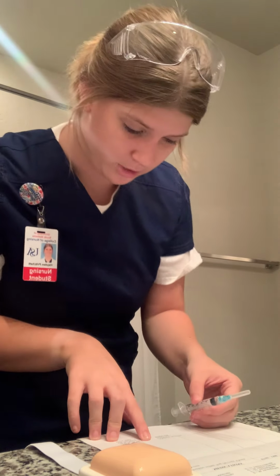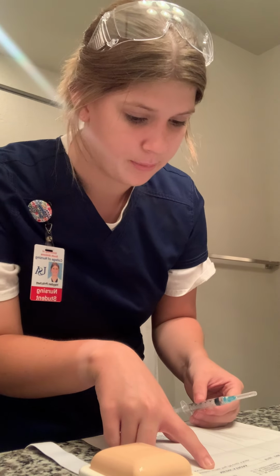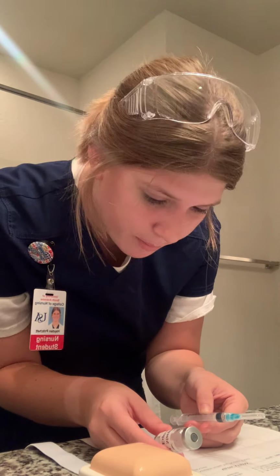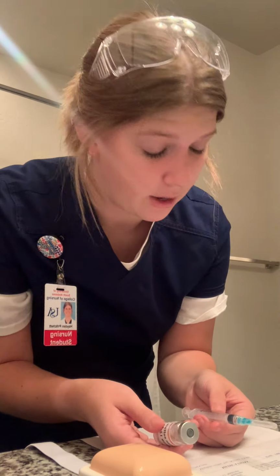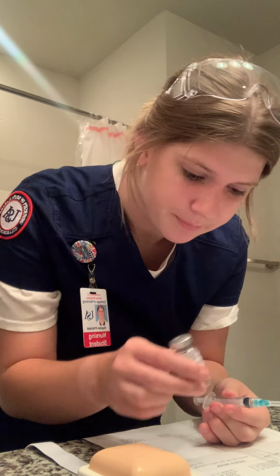So my patient is Jaguar J. Jones, and he is receiving morphine sulfate at 5 milligrams. And I have my morphine sulfate right here. I'm comparing them to the MAR. So yes, I have morphine, and it's at 5 milligrams, and the calculations are correct because it's 10 milligrams per 1 milliliter. Since this is a 3 milliliter syringe, it is a half milliliter.